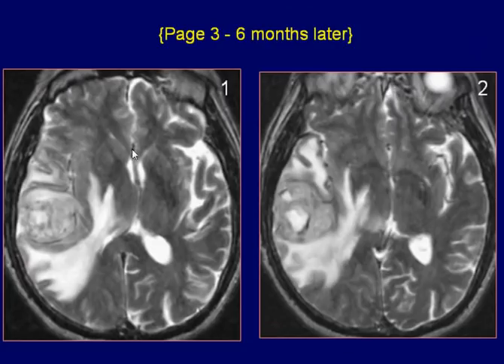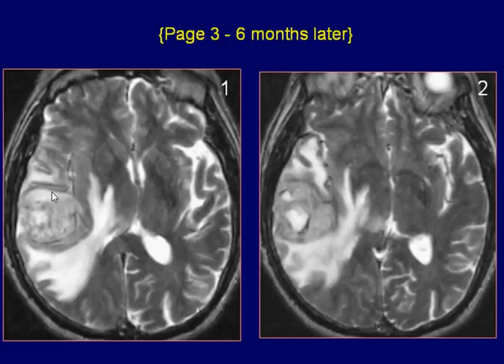Follow-up MRI examination of the same patient: axial T2-weighted images demonstrate the lesion as a heterogeneous area with significant interval growth in size. There is marked associated vasogenic edema and mass effect.